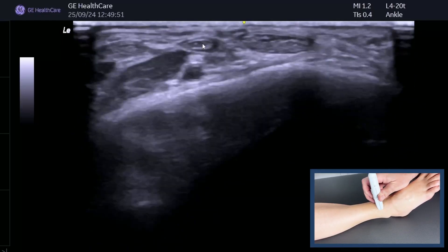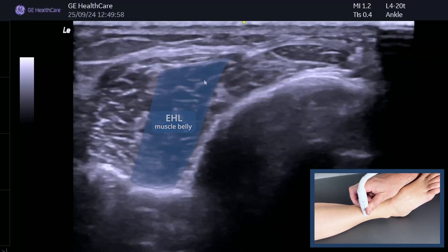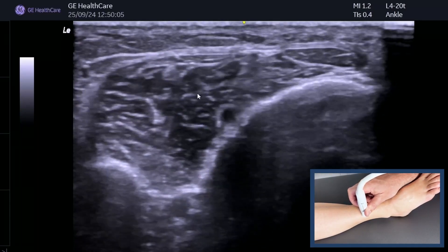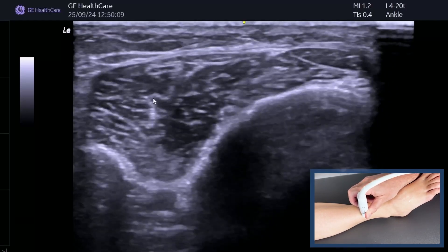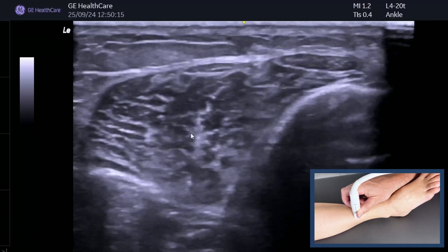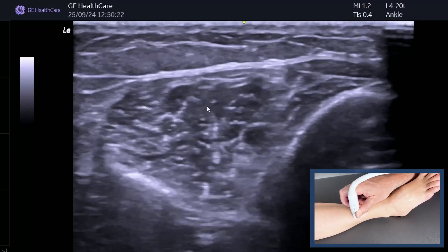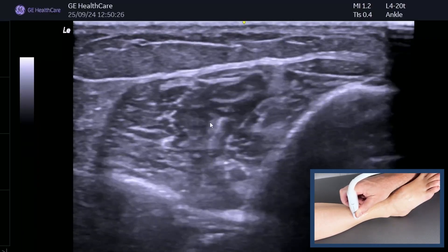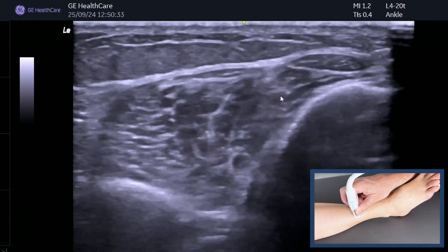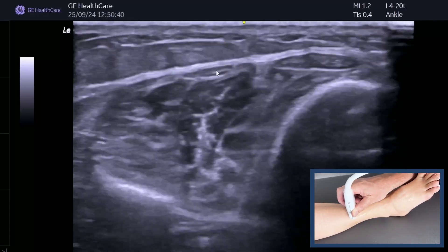As we follow EHL up we can see the muscle belly gets bigger and almost forms a column. You've got tibialis anterior here with its muscle belly, extensor hallucis longus here, and then there's another column which is going to be extensor digitorum. If you're not sure which is EHL, ask the patient to wiggle their big toe and you can see that column of EHL muscle belly working really nicely. Ask them to dorsiflex and you get the tibialis anterior muscle contraction, but wiggling the toe really differentiates EHL.